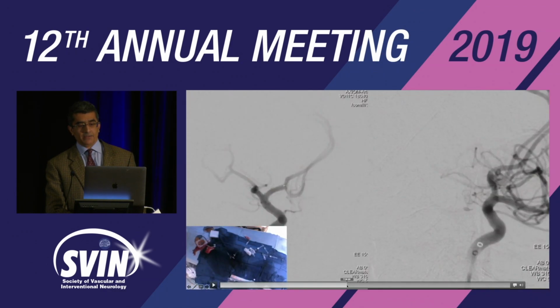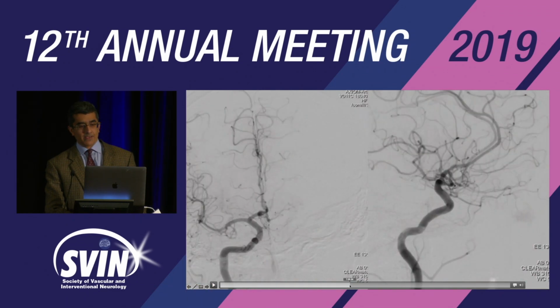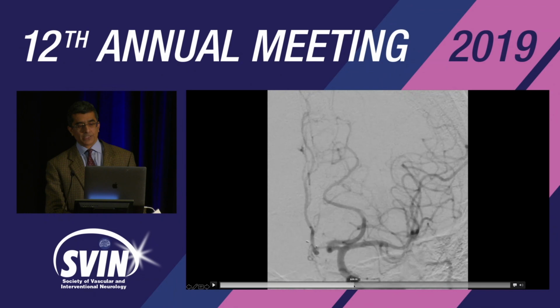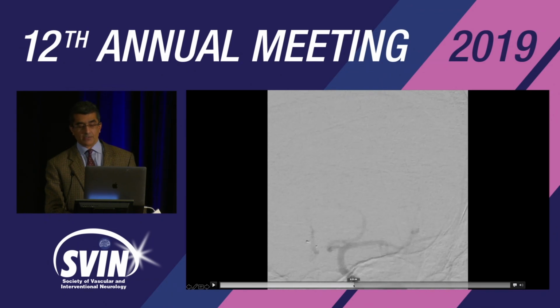This is the immediate detachment angiogram. After a couple of minutes, this is the final control angiogram. And just to be sure, we also checked the contralateral side to make sure there was no occlusion on the other side.